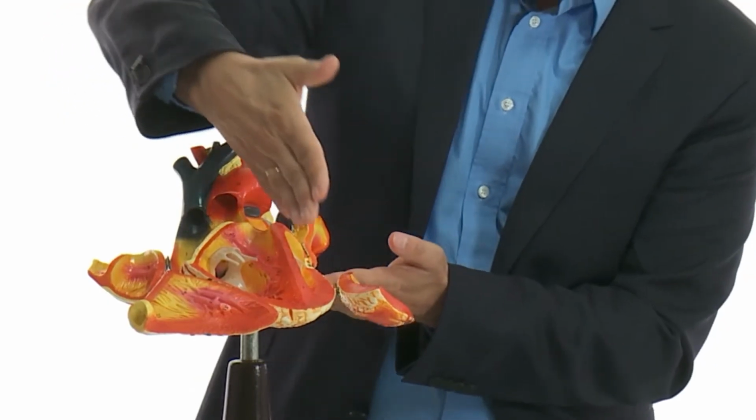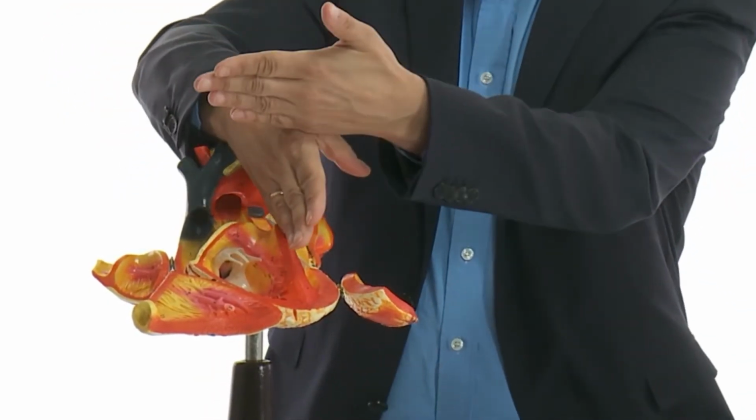Yes, that's certainly a problem. You can either change or misplace the rotation, or you could sometimes lose the position on your axis of the heart. So the tip that I would like to give you is stay, first of all, in the axis of the heart. Try to be perpendicular to this axis. And second of all, rest your arm firmly, and especially the hand firmly on the body, so that you don't tilt in either direction.